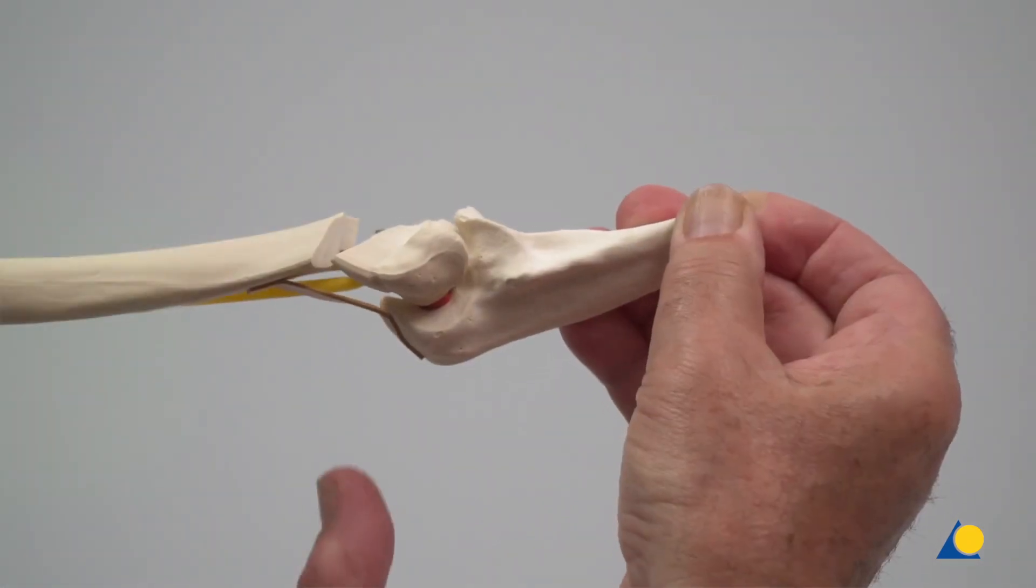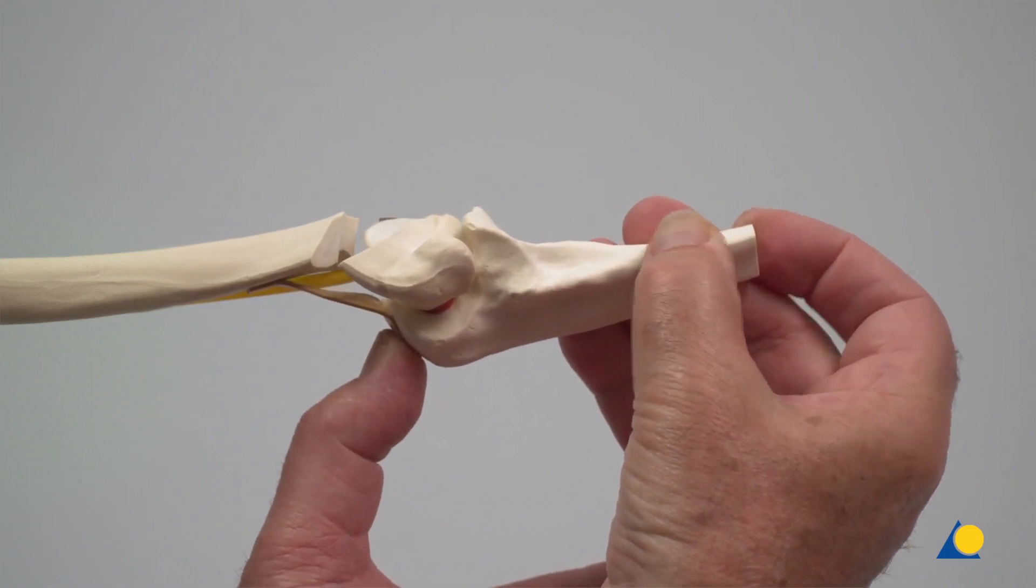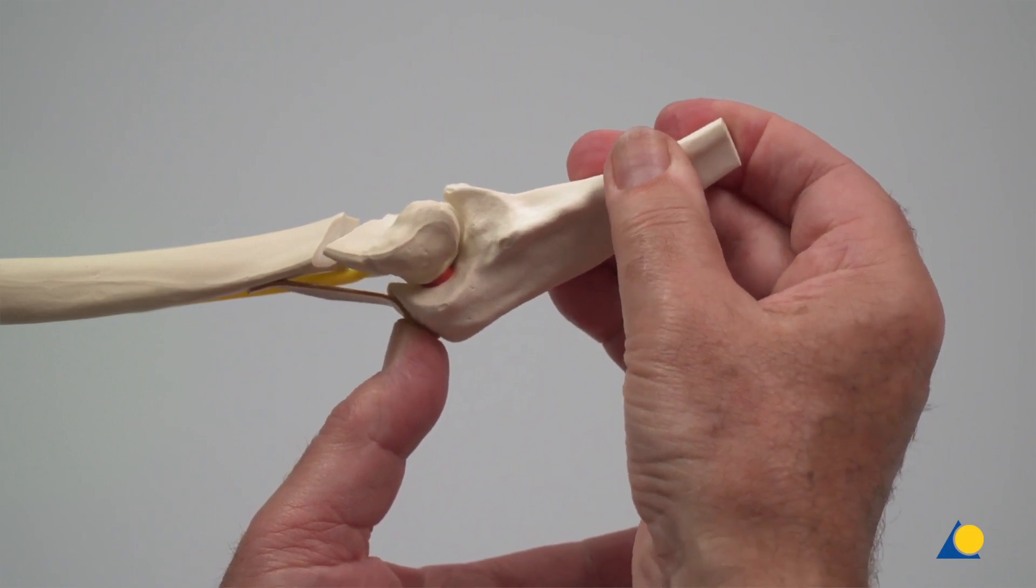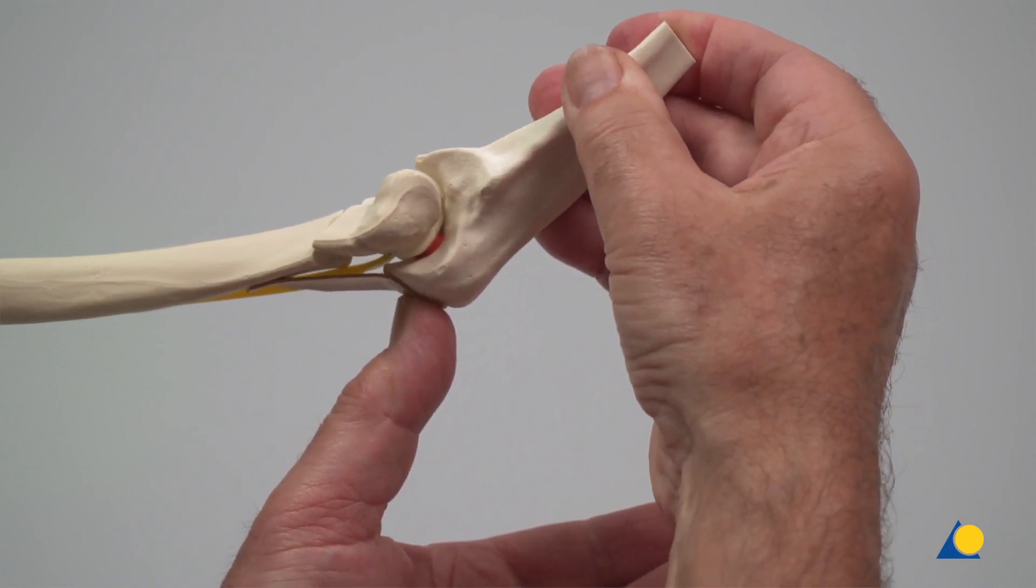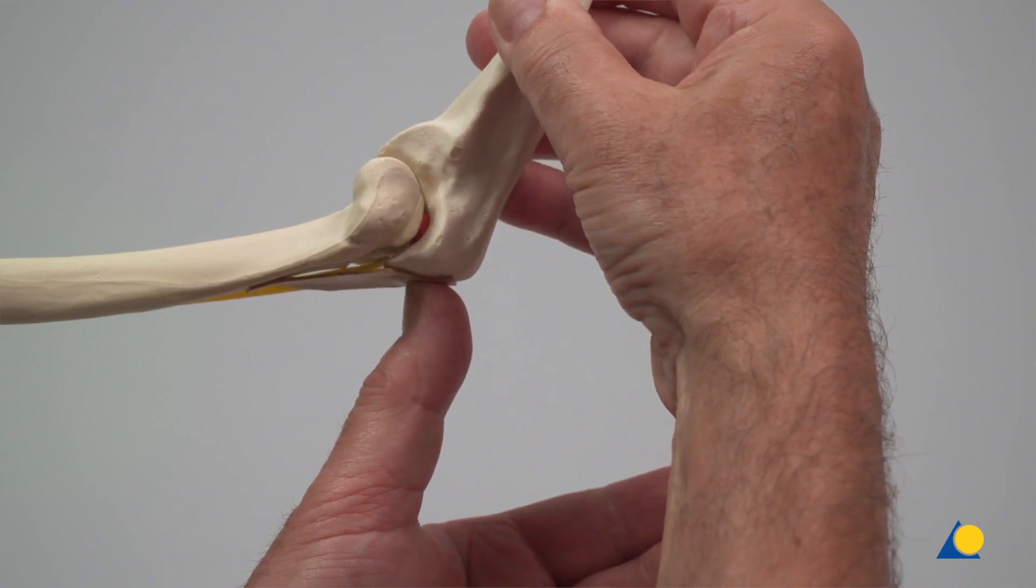If reduction is proving to be a challenge, the olecranon can be supported by hand and the fragment positioned and reduced by manipulating the forearm. To verify that the fracture is correctly reduced, the forearm is flexed.